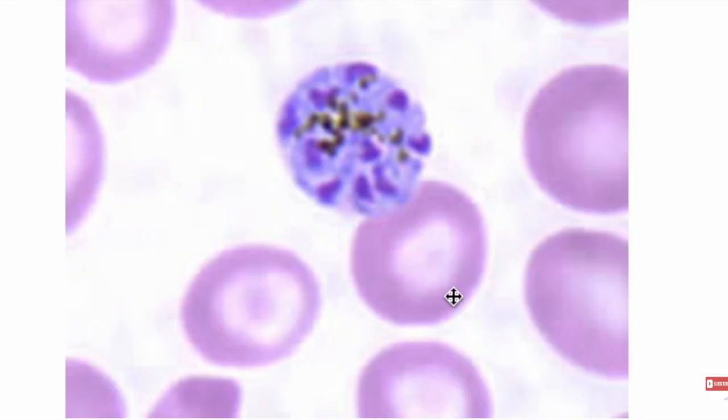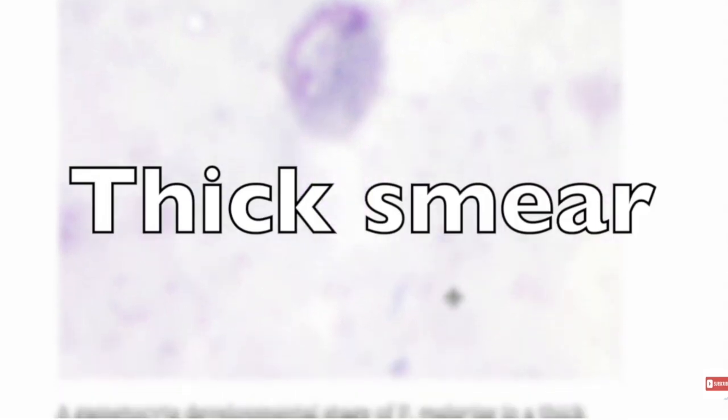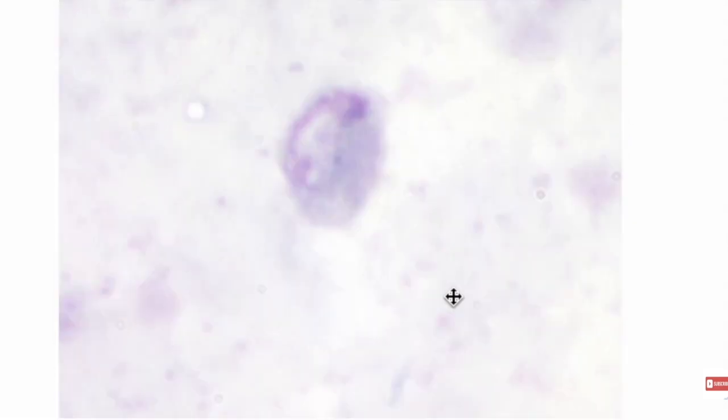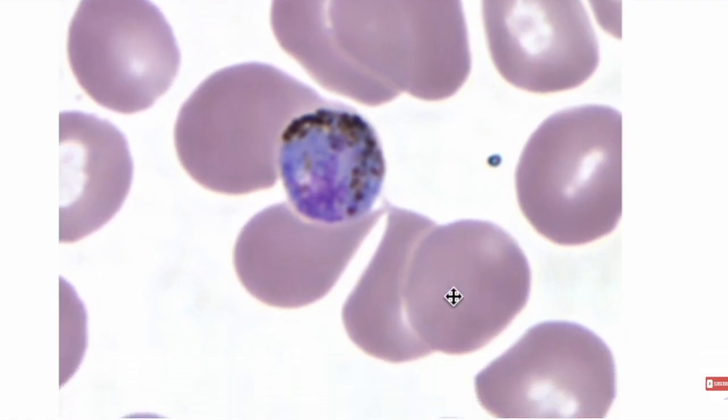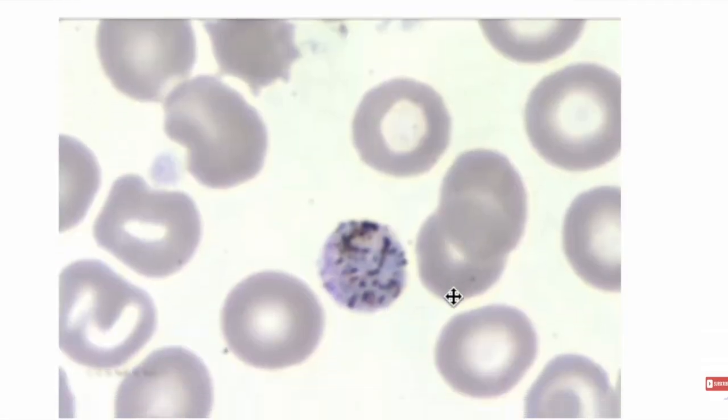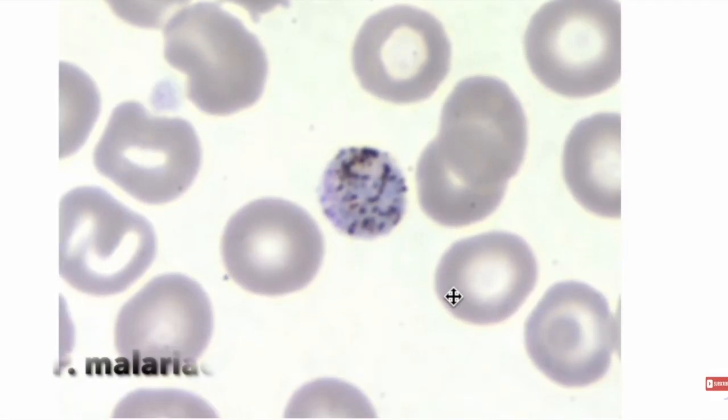And then there's another useful contrast with P. falciparum. The gametocytes of P. falciparum are famously crescent or banana-shaped. You've seen them. You see one of those and you immediately think, falciparum. P. malariae gametocytes, on the other hand, are generally round or oval. So it's giving a bit more like the vivax morphology. So morphologically, there are some really interesting clues.